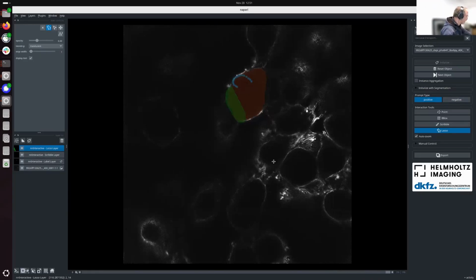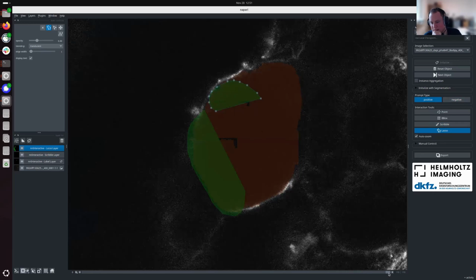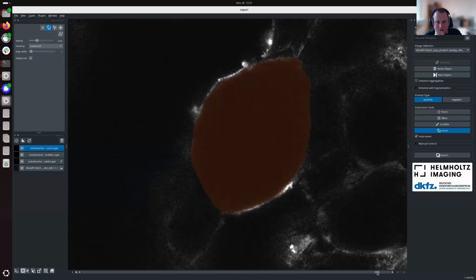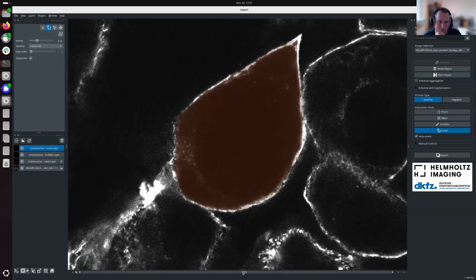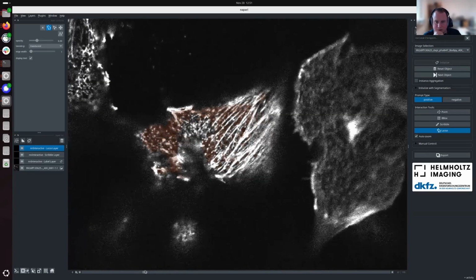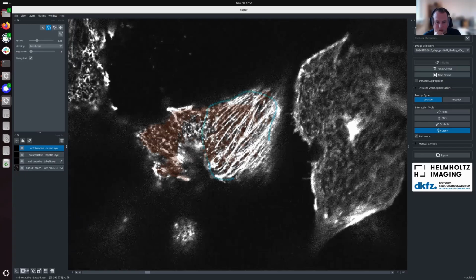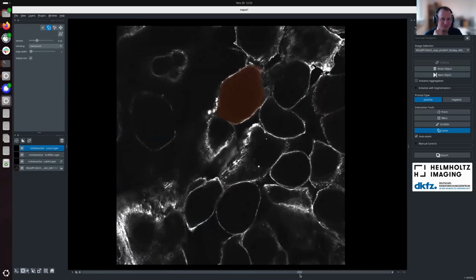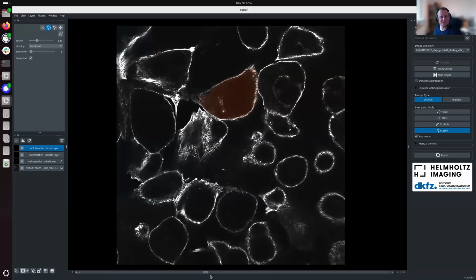And awesome. It's impressive. Yeah, you see a bit of a limitation here, which is something we are currently addressing. It's always the last couple slices that, for some reason, sometimes have holes that are difficult to get rid of. So this is a known issue, but we're working on that. So I think we're doing an okay job here. It's of course debatable if we want to include that part here or not. But yeah, seems to work. Success, zero-shot generalization. Cool to see. Thanks for sharing the image.